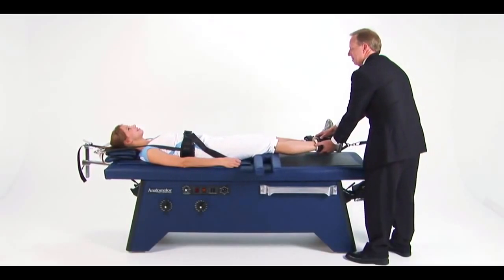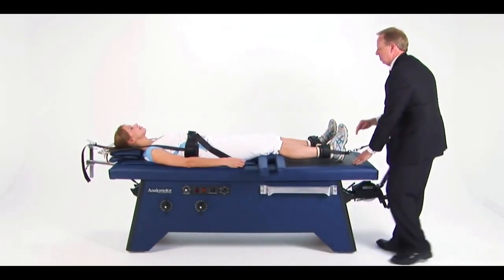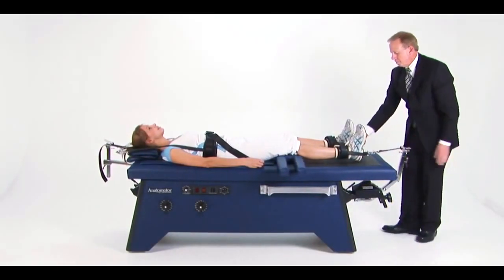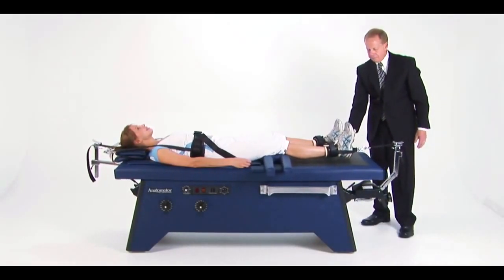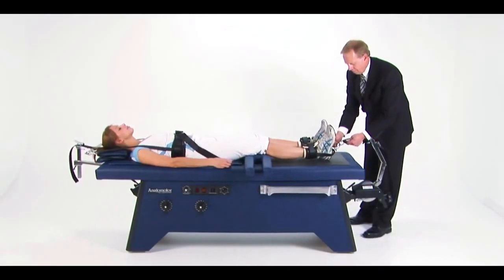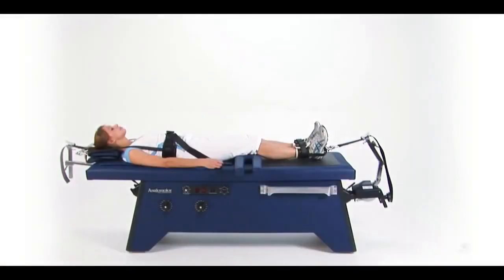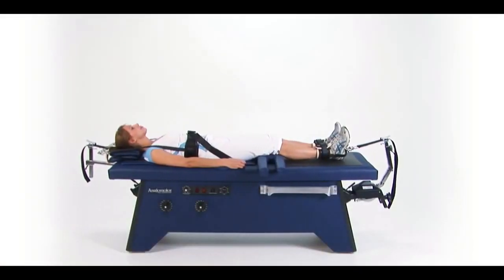Treatment may now be given to the affected leg, and poundage may be gradually increased for assisted manipulation. After 5 to 7 minutes, it's advisable to pull on both legs again for another minute or 2. This will help equalize the muscle structure in the lower back. Removing the insert block from beneath the knees will increase traction in the hip and knee area.